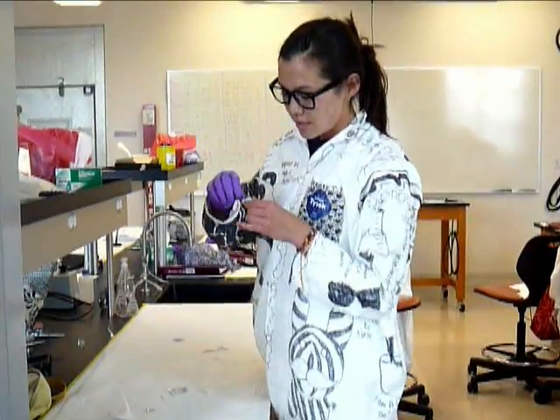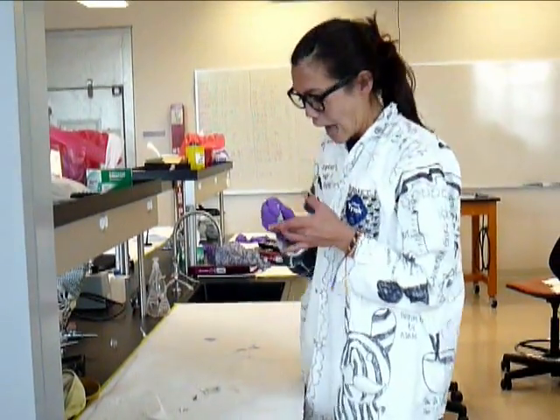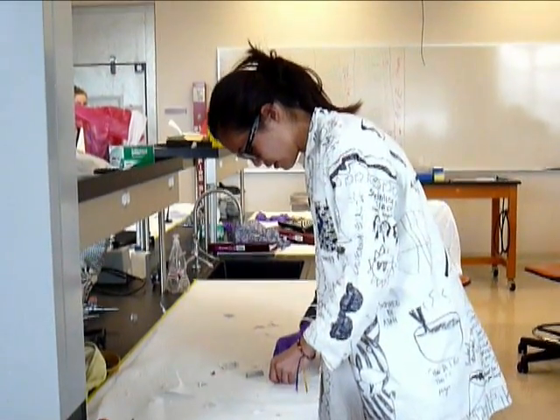And you push down the lancet stick, twist it off, put it to your finger. And then — see? Blood. There's not a lot right there, but it'll do for now. And then you grab it with the tube.